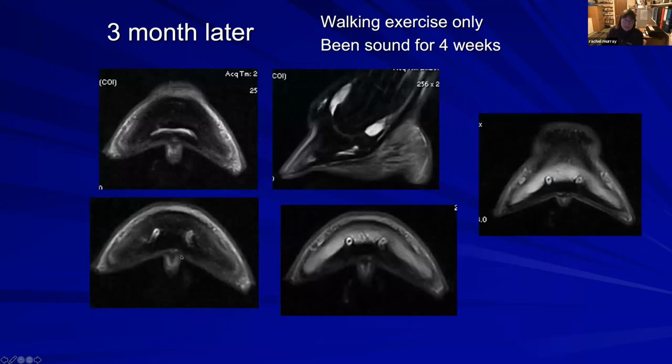Three months later, that has completely resolved in that area, and we've only got a small amount of fluid signal left. So the horse has been sound for 4 weeks and went gradually back into work at this point.